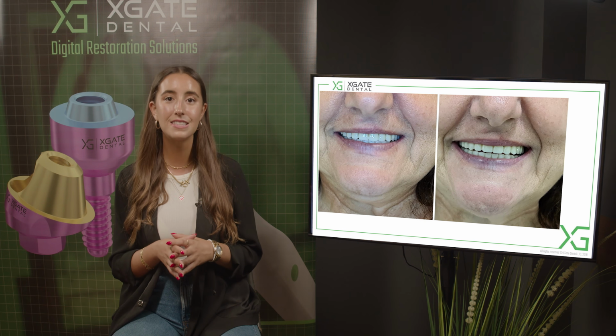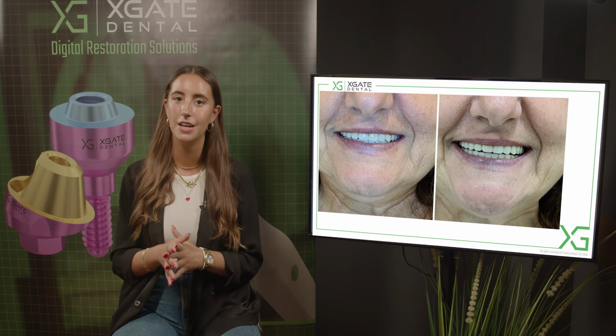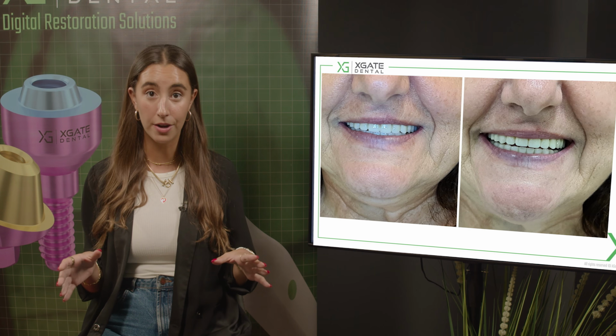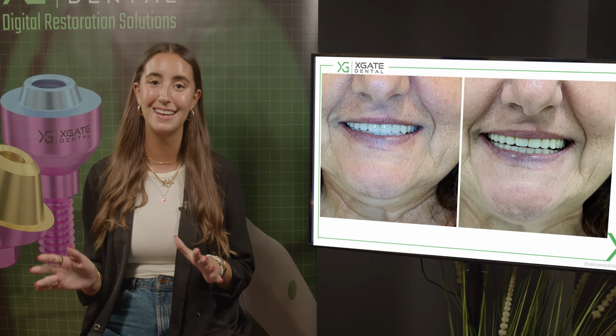In this, you can see that the bridge is a little bit whiter and here a little bit yellower. But all in all, you can see that all over it is the same level. It's much better than what she had before. The midline is great and the smile looks fantastic.